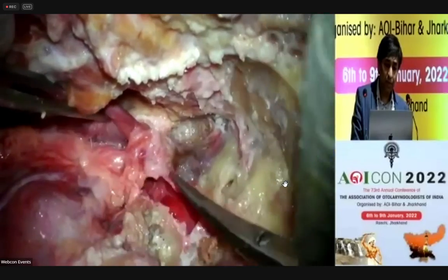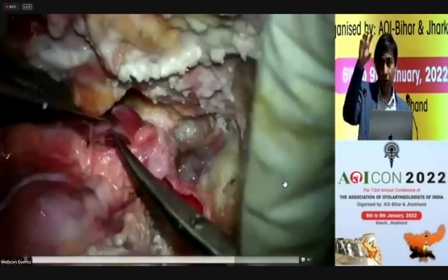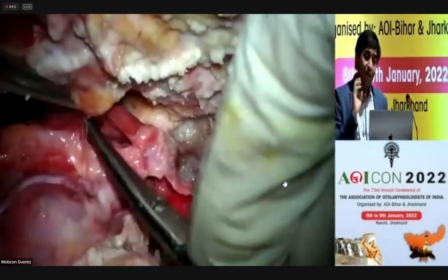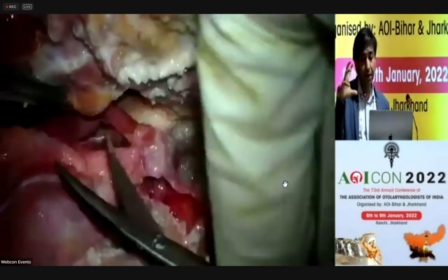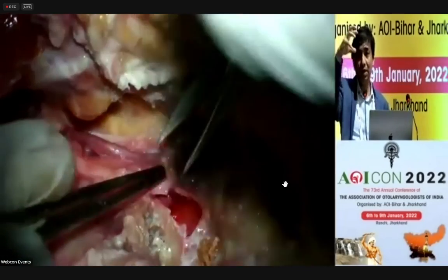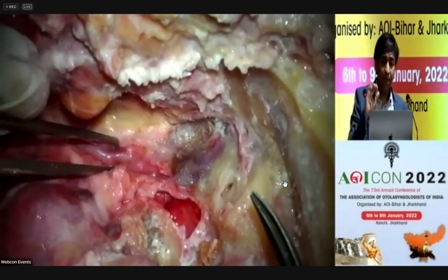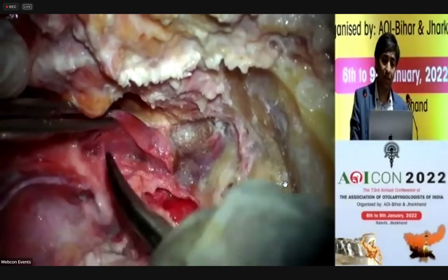One needs to separate the tumor from the carotid. Again, this cuff of tissue around the carotid, around the jugular bulb, is a matter of confusion for the uninitiated. This looks like tumor. A lot of times there is a fibrous band in this area because it's a skull base, going from normal anatomy into bony anatomy. So there is this fibrous cuff of tissue, you see what I'm doing, I'm cutting it with scissors. That's not really the carotid, but the cuff of fibrous tissue around the carotid, which can be safely removed.